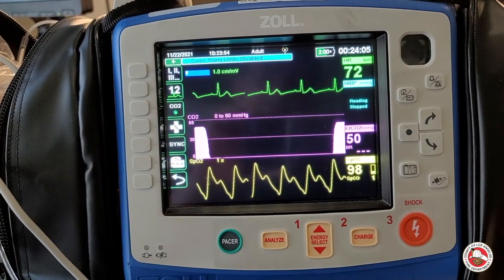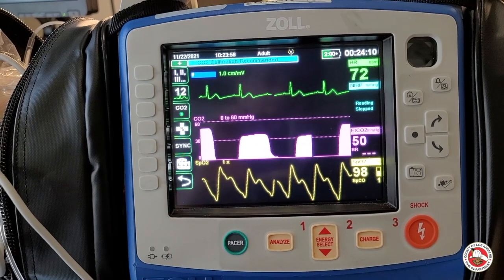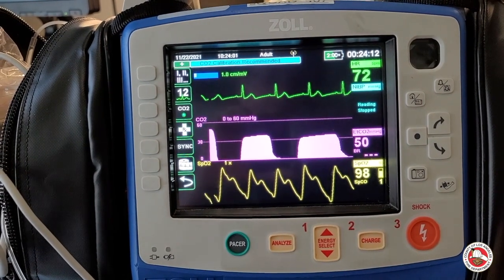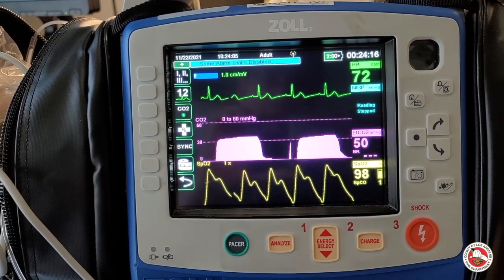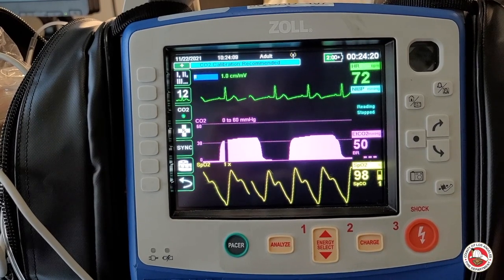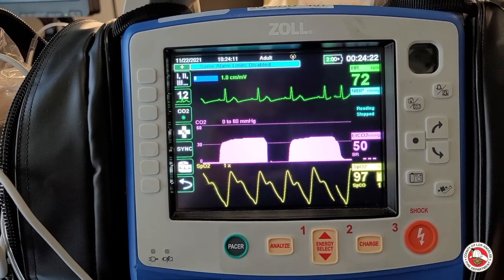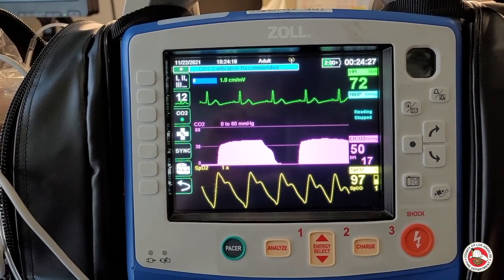I finally couldn't hold my breath any longer, and so you see those big breaths blowing off that retained CO2, hence the number 50. This is why capnography is such an important addition to your patient monitoring. It gives you instant feedback about patient's ventilatory status that O2 saturation just can't provide, allowing you to intervene earlier before serious and irreversible problems develop.